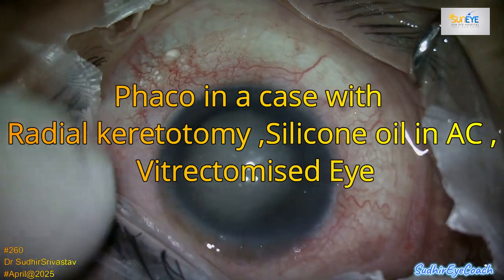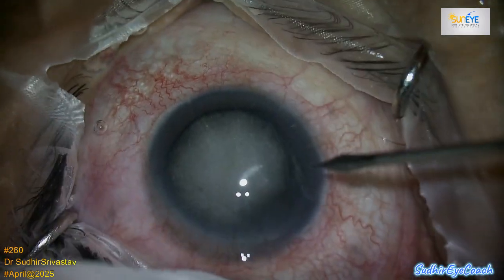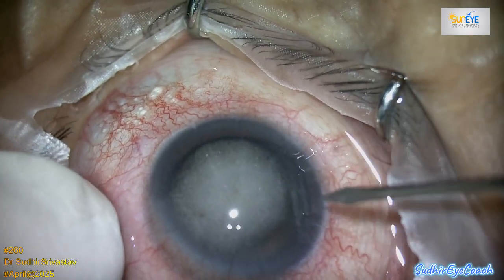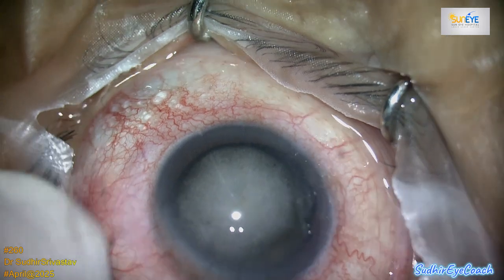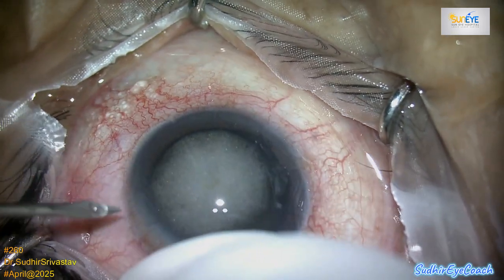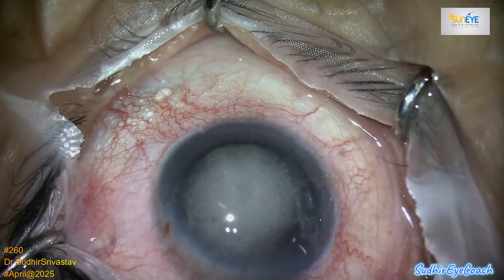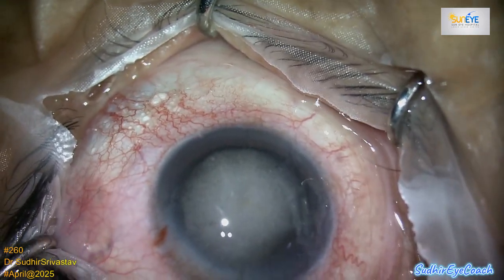Today I am sharing a unique case involving a patient with radial keratotomy scars who had previously undergone vitrectomy with silicone oil tamponade due to retinal issues. The patient subsequently developed a cataract and we now needed to perform cataract surgery in the presence of silicone oil within the anterior chamber.